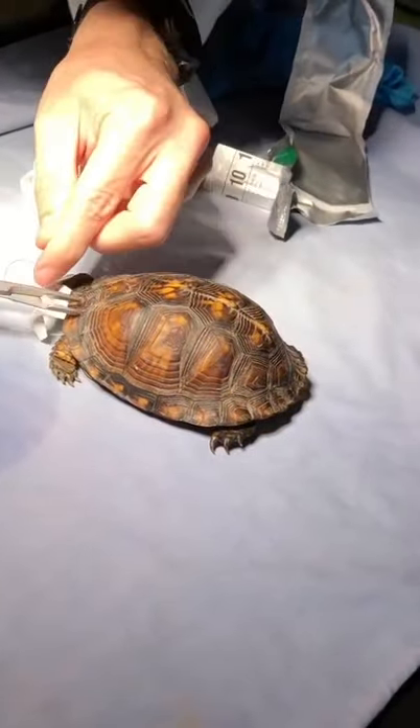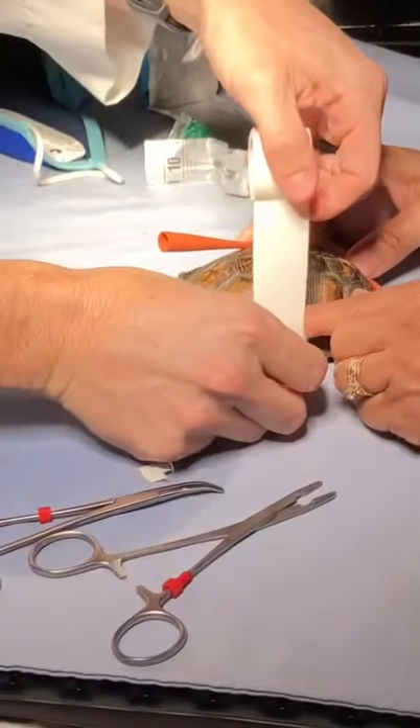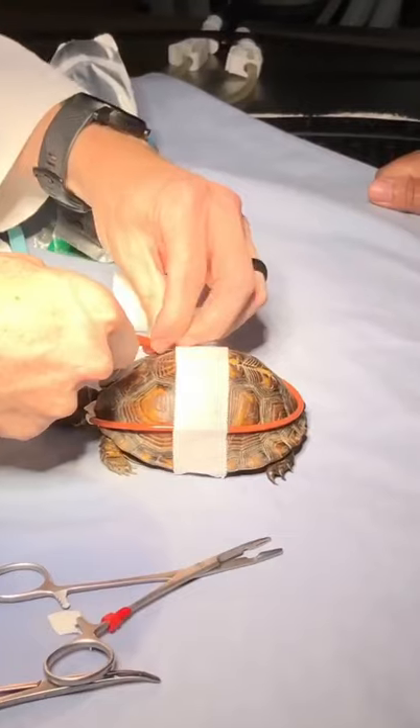he is attaching it to the turtle so that it does not slide in or out of place. And now we are taping the feeding tube to the shell so it's out of its way.